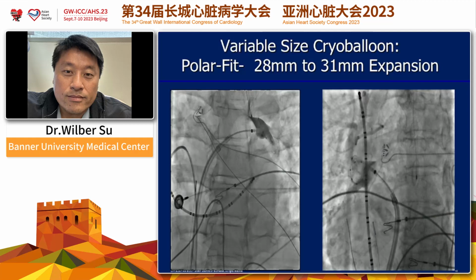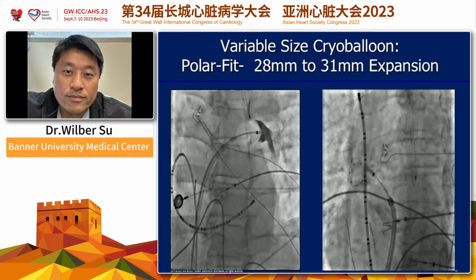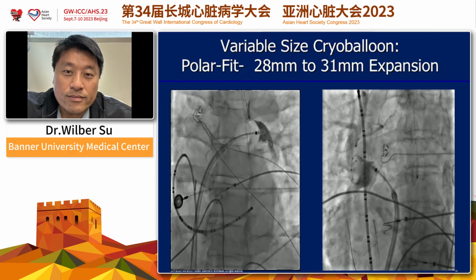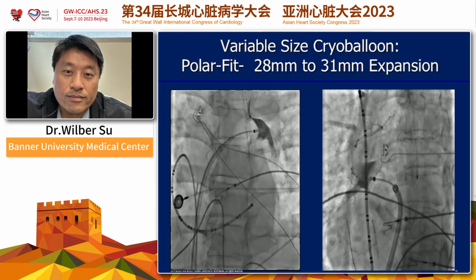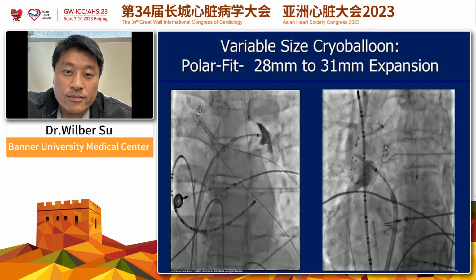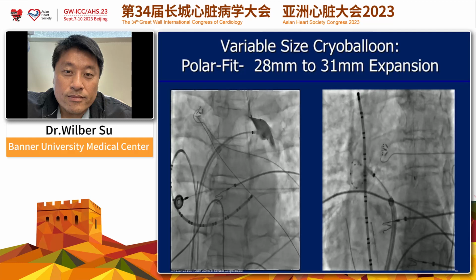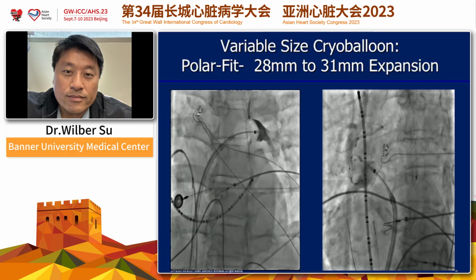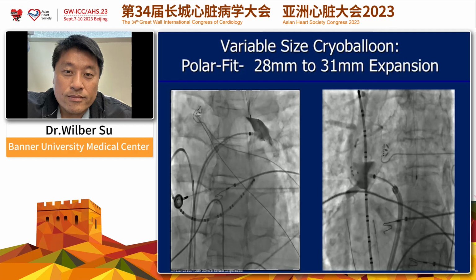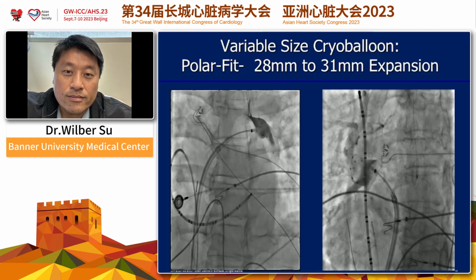So my objective in the PolarFit trial, as I looked at the protocol, is that we really need to look at how it really benefits as we shift from 28 to 31. So we did a whole collection of our PolarFit trial patients with more of a continuous contrast injection. So if you keep an eye on the balloon as we enlarge from 28 to 31, you'll see that it actually moves more antrally. And even some of the balloons that have a leak, like the one in the right superior vein that leaks inferiorly, as it enlarges, they actually engage it perfectly.